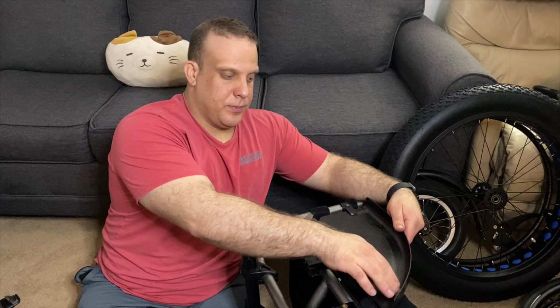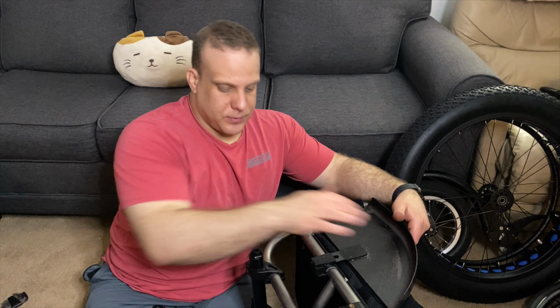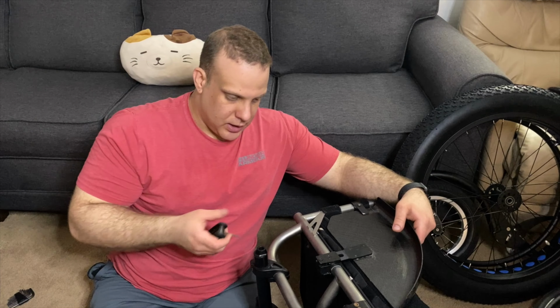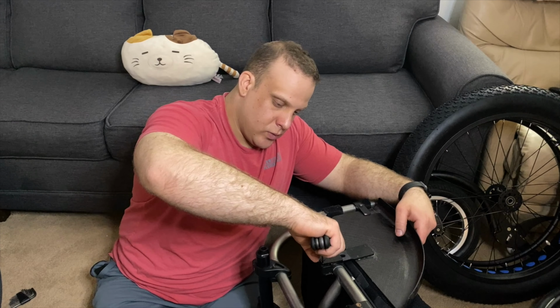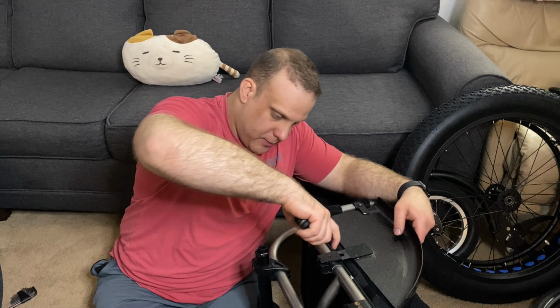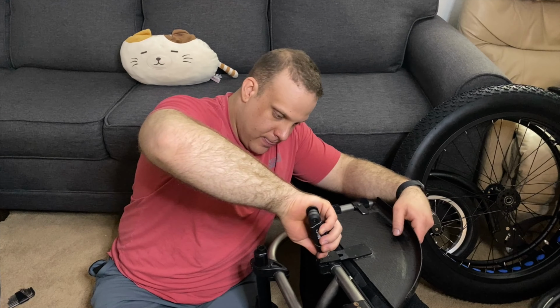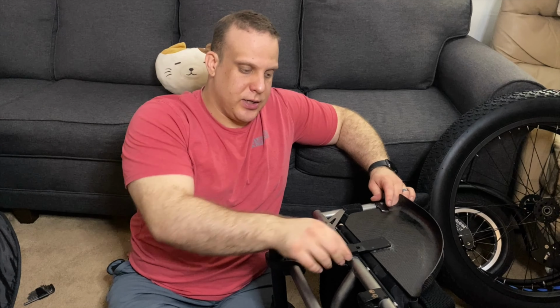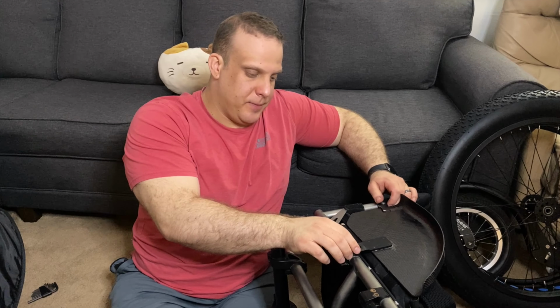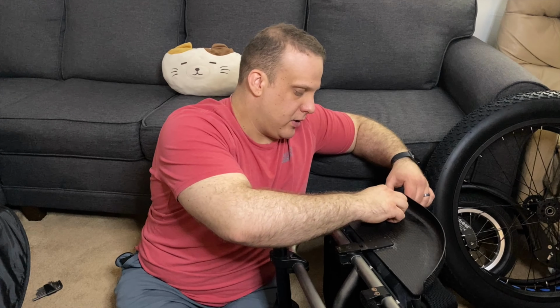it won't rub on this, I don't know what you call it, wheel well type side guard. So I loosened them up, I slid this up just a little bit, and now we'll tighten them back in. Okay, so I actually just had to do a little final adjustment there because I slid it up too much and it wasn't grabbing, but now that side guard is securely fastened there again.